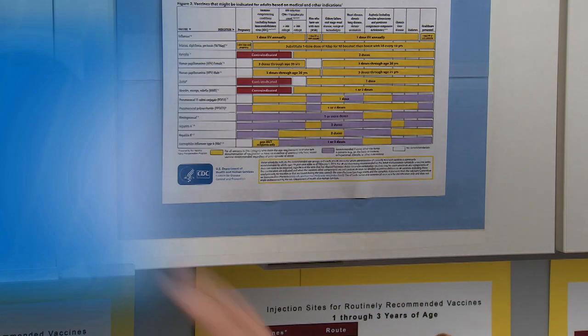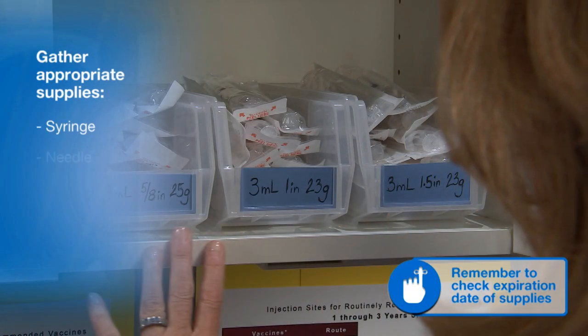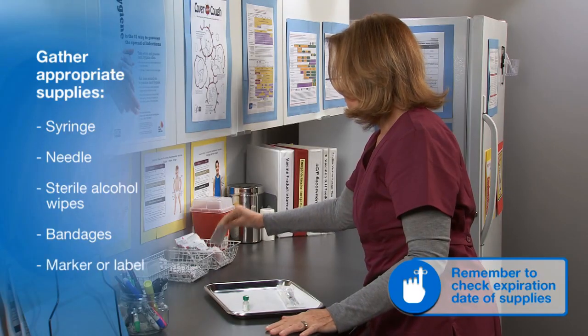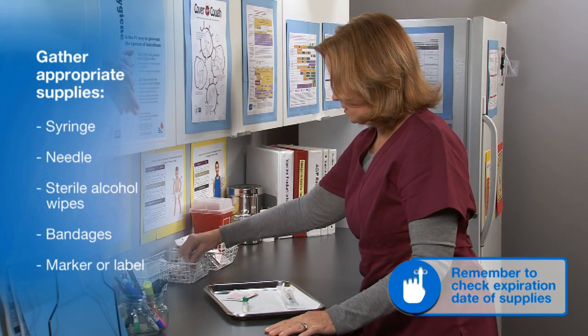To begin preparation, gather the appropriate supplies. This includes a syringe and needle, prepackaged sterile alcohol wipes, and bandages. A marker or label will be needed to identify the vaccine once it is in the syringe.